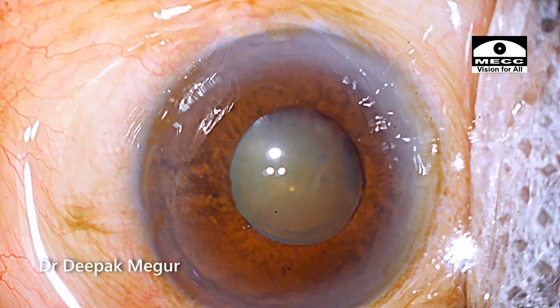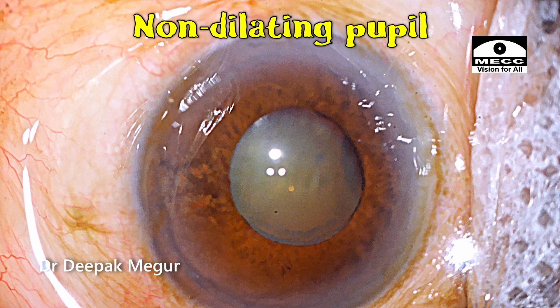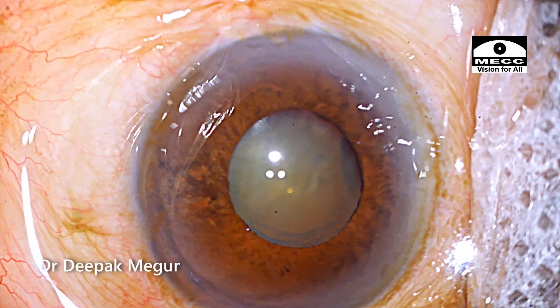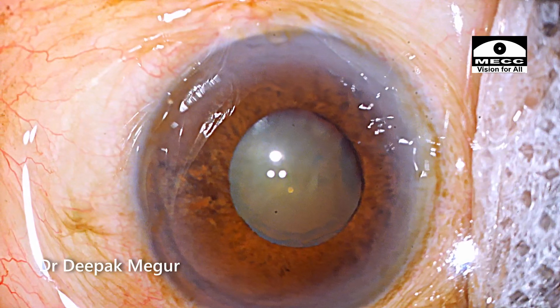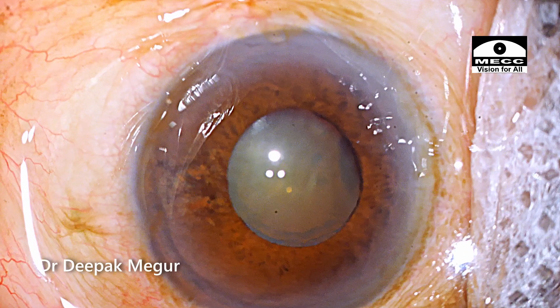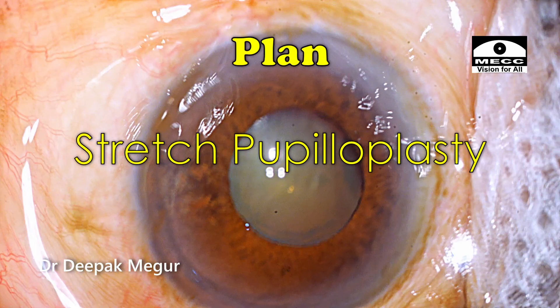This is a 65-year-old gentleman who has pseudo exfoliation and a non-dilating pupil. This is the maximum pharmacological mydriasis which could be achieved in this patient. The cataract is not dense, so managing the nucleus might not be an issue here. But I'm going to use a stretch pupilloplasty in this patient to deal with the pupil expansion.